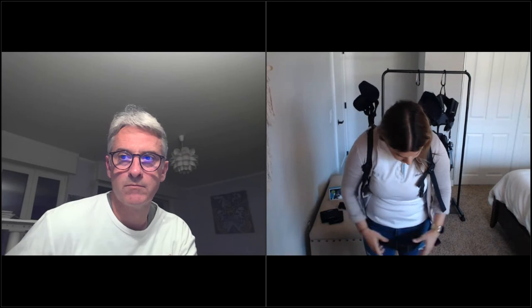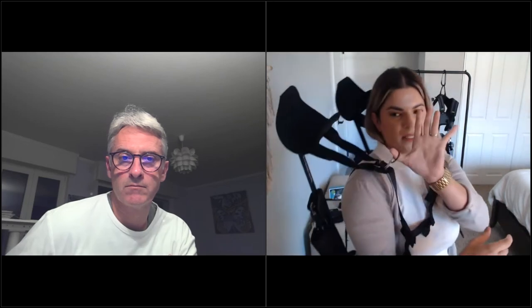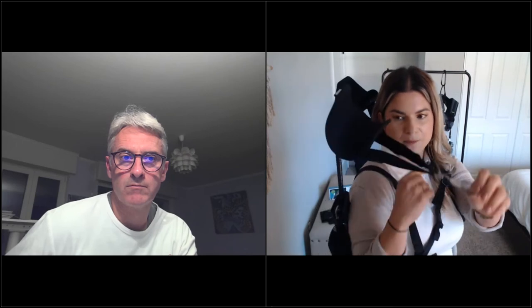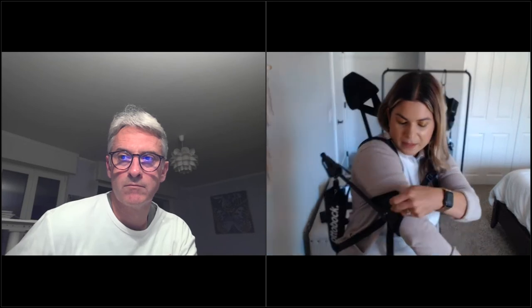So much like a backpack, you're simply just gonna put it on. And then you have the hip belt. You want to tighten this, make sure it's low and tight on the hips. The chest belt, this can be loose, this is just to keep it stable. And then simply you're going to take, I always use the thumb opposite hand for the arm, and it's magnetic here, so you're just going to pull it out and then simply put your arm into here and then cup it. And then reverse that on the other side as well.